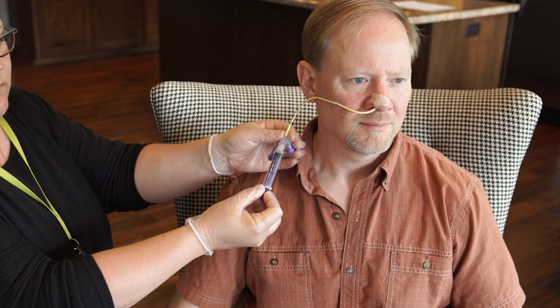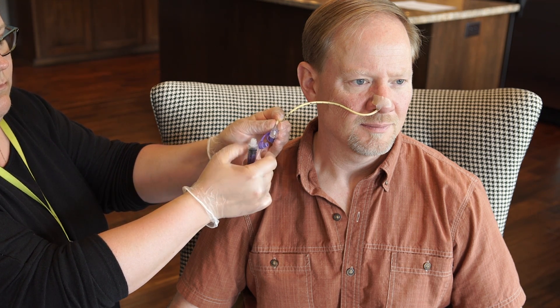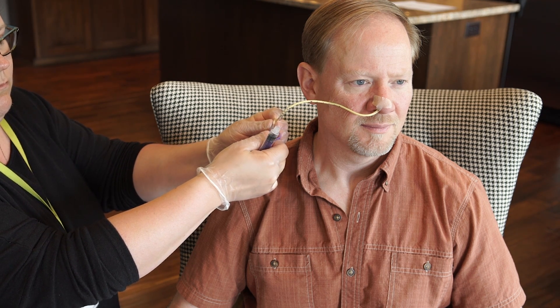If you do hear the sound of air entering the stomach, pull back the syringe plunger to remove a small amount of stomach contents. Disconnect the syringe from the tube and close the cap on the port.